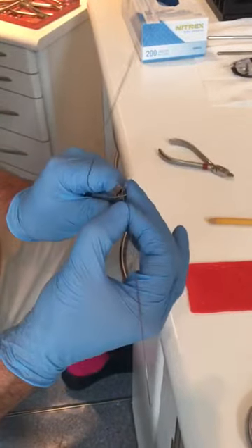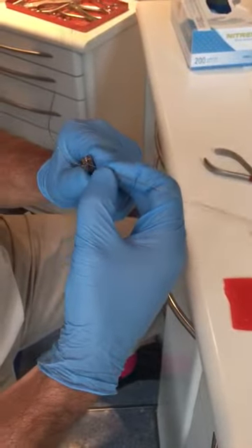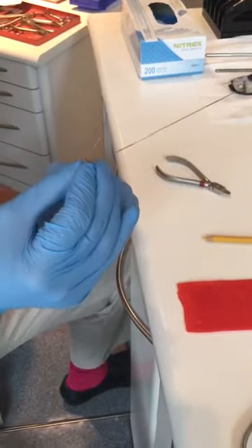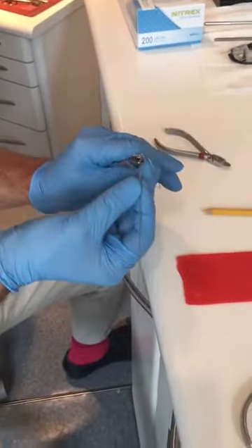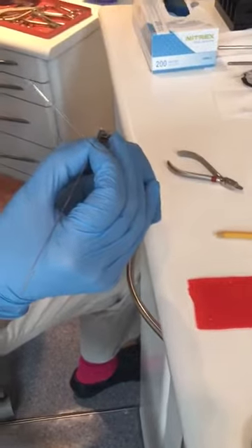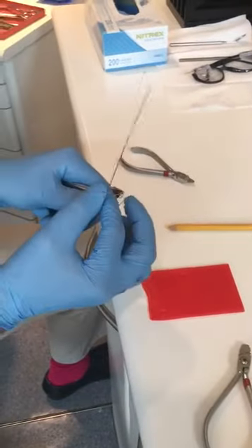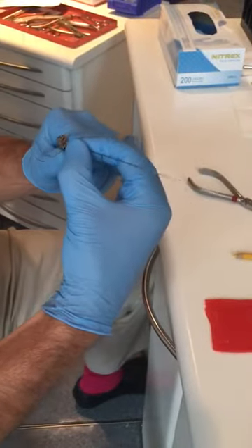And the idea of the double delta is that you can correct the vertical, the horizontal, and get some torque, all with the same arch wire. So the only bit that's a little bit tricky is the very next bend we have to do, because I have to get this bit of arch wire on the other side of this bit, this wire here. So you have to kind of flick those over each other like that, and then bend it down.